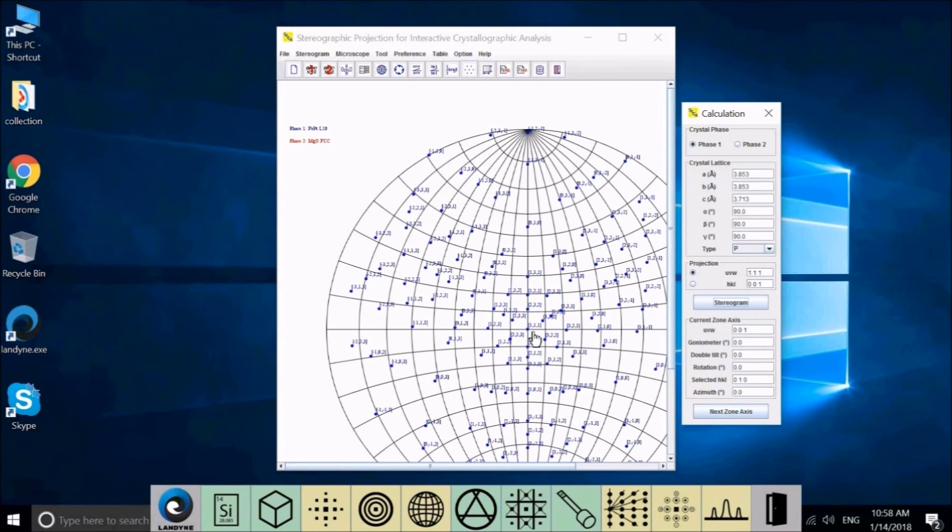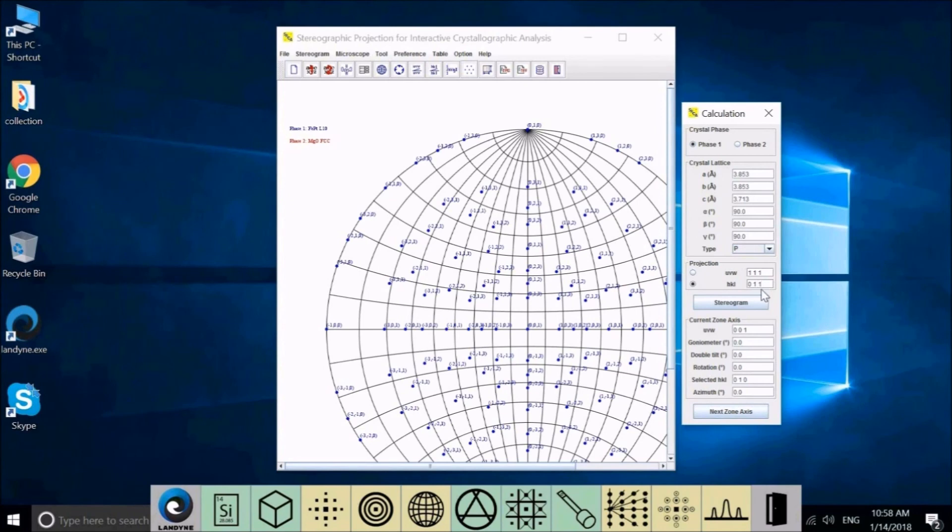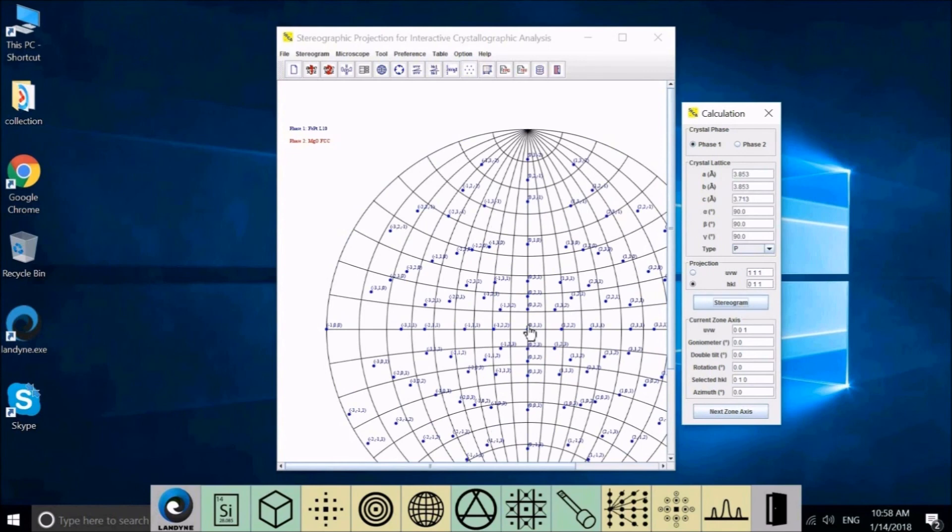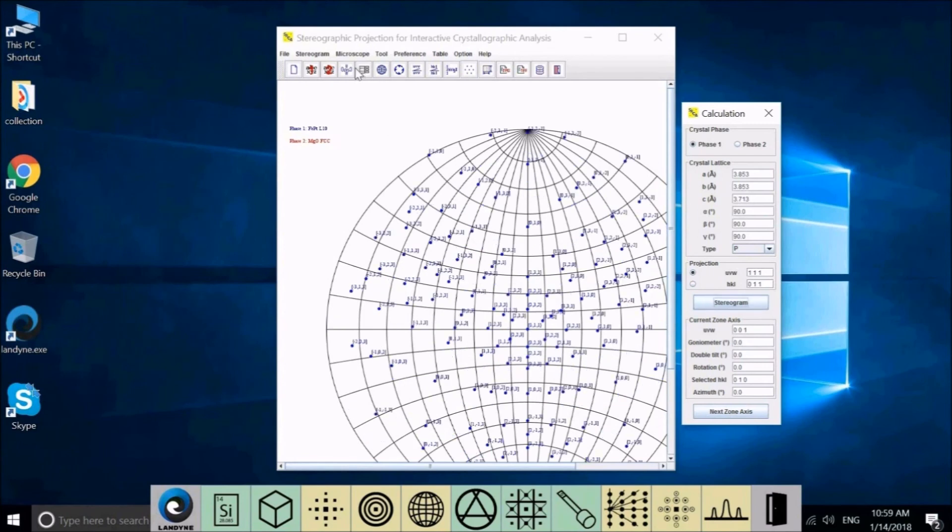And for the reflections, we need to test for 0, 0, 1. Let's test for 0, 1, 0. And you can see before we change, the center point is 0, 0, 1. And we do stereogram. And now the center point is 0, 1, 0.